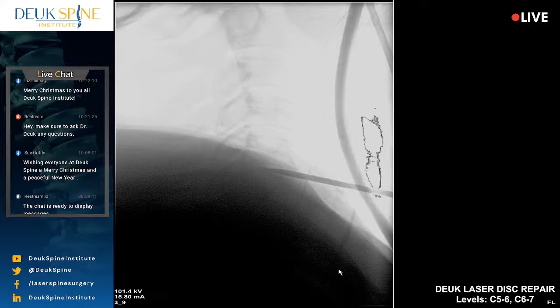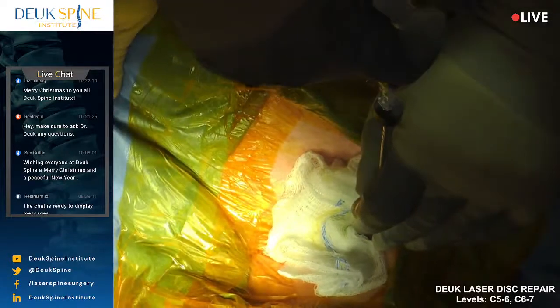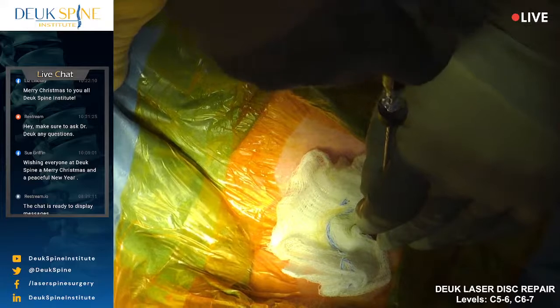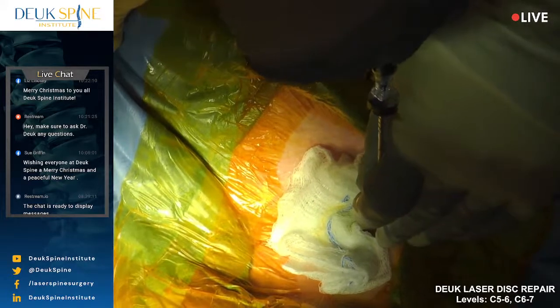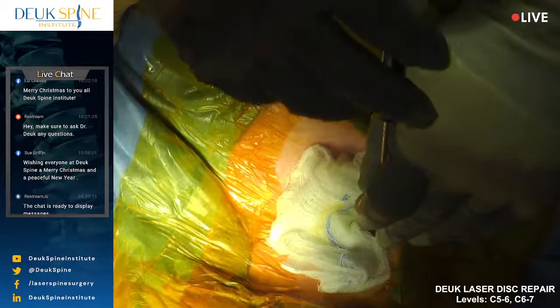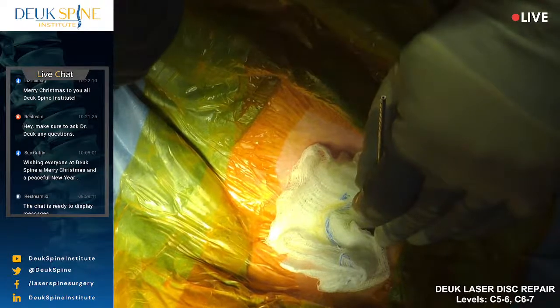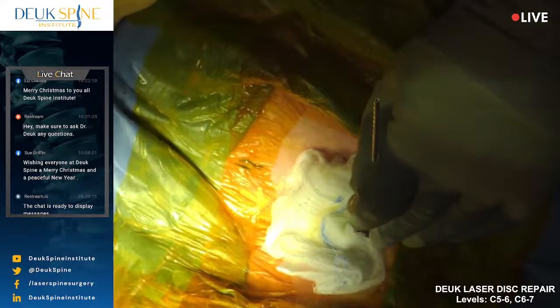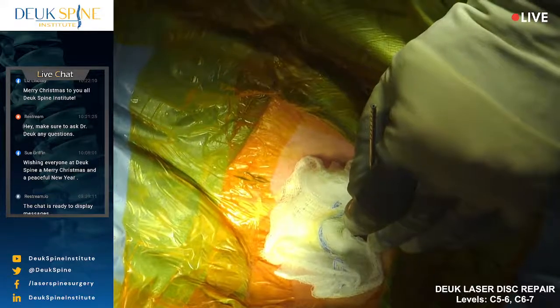All right, now we're going to do our discogram. Luis, I'd like you to give me a little shoulder pull. And it's just the last time we'll need, oh, actually, probably the last time we'll need a little head pull. It's not wanting to go. I don't know if I got any out. Doesn't look like it. All right. Let's see. All right, relax, everybody. Take this. Let's get the pipe cleaner again.